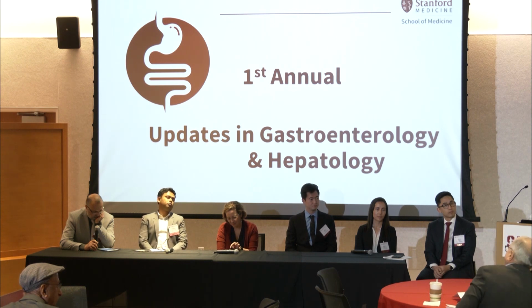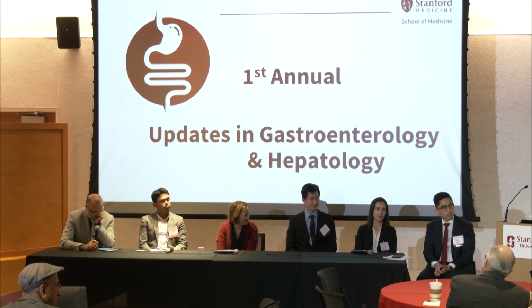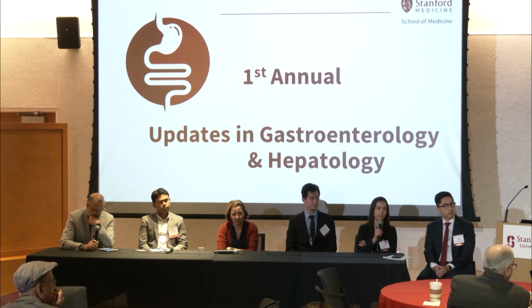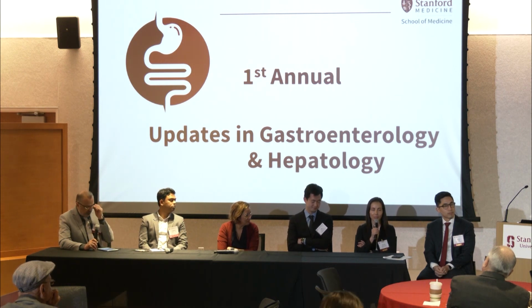So in these people who, let's say, are idiopathic and they're 30 and young and otherwise pretty healthy besides gastroparesis, which is debilitating, do you think it's wrong for people to be going straight to G-POEM before doing the trials of tricyclics and Buspar and Botox and all of these other things that we do that don't always seem to work that well? No, absolutely. And I thank you for pushing back on that, because I do think that's where things are going.